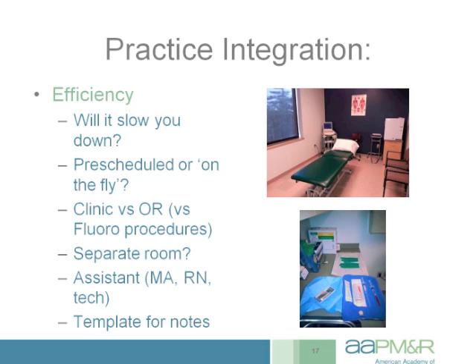Sometimes it's difficult to predict we're going to be doing the procedure. In some cases, the orthopedic surgeon might be referring to me, and it might say in the consultation request that we might be doing an ultrasound-guided hip joint injection, for example. So we kind of know what's coming, and they'll already be in the ultrasound room. In some cases, I'm seeing a patient in follow-up, and I've been previously seeing them for neck pain. They mentioned some lateral hip pain. We ultimately diagnosed trochanteric bursitis. If they have a high BMI and I think a non-guided injection is not likely to be highly accurate, we might just then bring them across the hall for the ultrasound-guided injection.